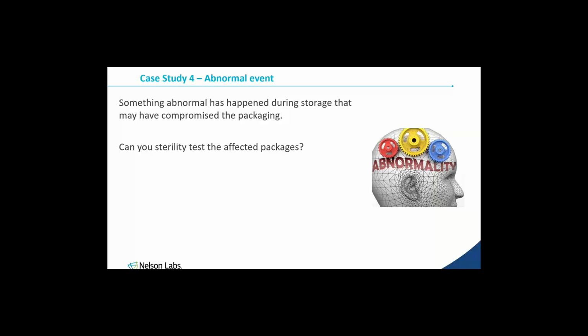Do I want to wipe that down? Is that something I really want getting processed into a hospital? So I have to look at the entire situation. Is a sterility test really showing my product's okay? No. It might still be sterile, but one of the sayings we have is clean doesn't mean sterile, and sterile doesn't mean clean.